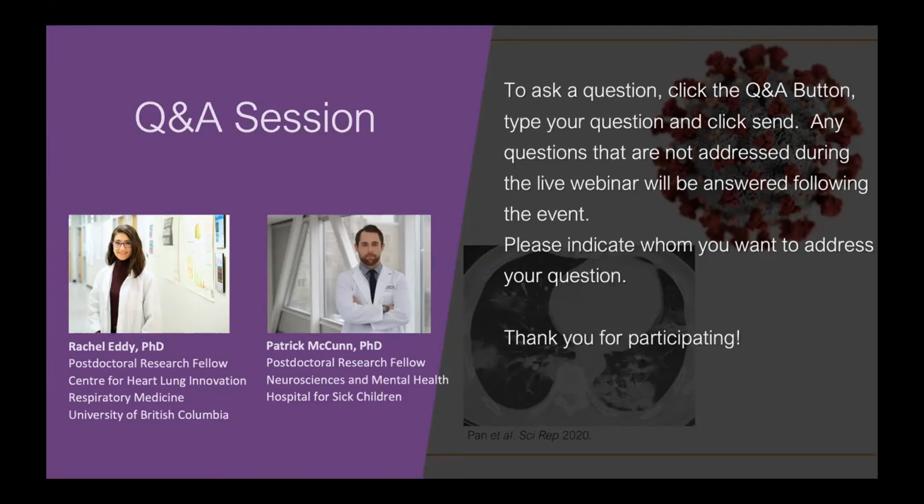If you're thinking of, say, integrating something like the SimPET with an already existing system, it begins to get a little more challenging, but certainly doable. There's various, again, software options, and there's also a lot of third-party software options to do quality control on these images, depending exactly what you're looking for. If you're looking at MR time course images, there's a lot of registration possibilities when it comes to correcting for those sorts of motion artifacts and things like that.